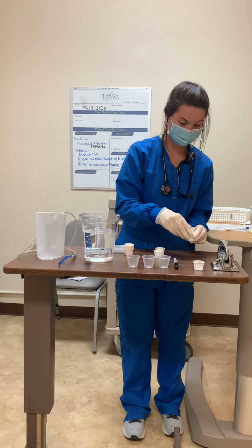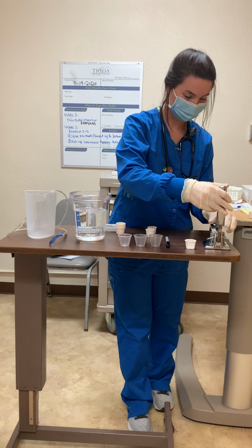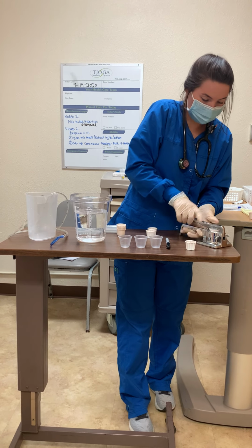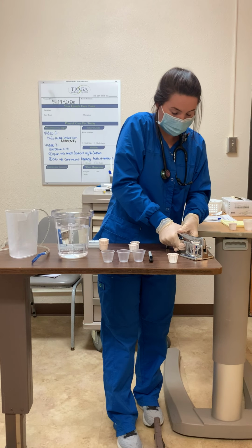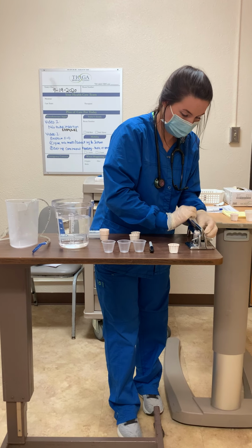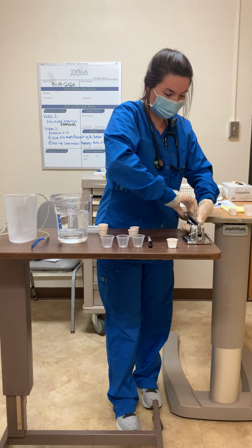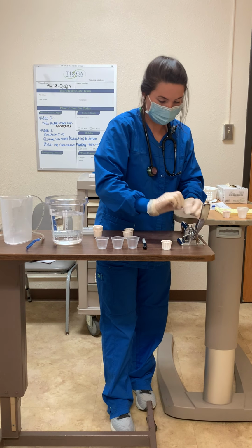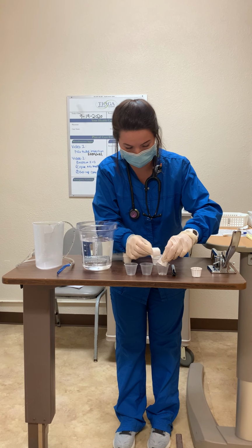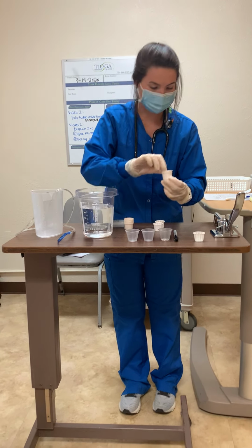Then we're going to go ahead and crush these ones. Aspirin right into this cup here. Make sure we have all of it out.